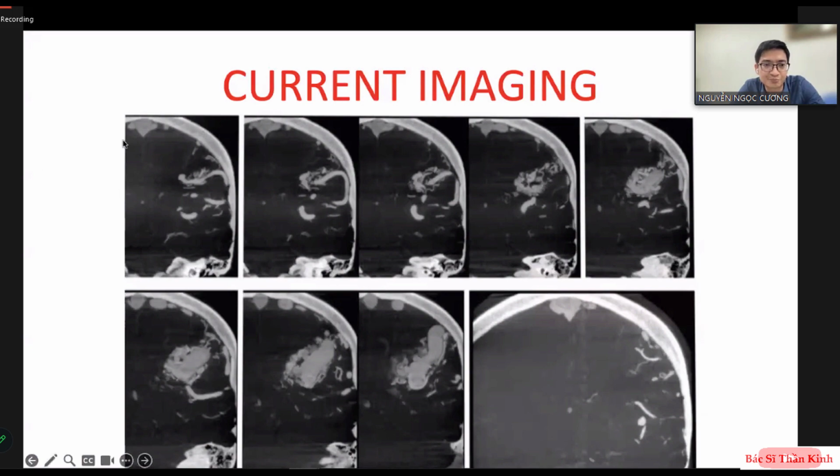Here we put the catheter into the left internal carotid artery and we inject the contrast. And during injecting the contrast, the C-arm continues to take pictures. By that way we have the image as a dynamic image in multiple phases. Here we see only the arteries without the vein. Here we start to see some tiny nidus, and in this phase we see the arteries and some nidus, but we don't see the vein.